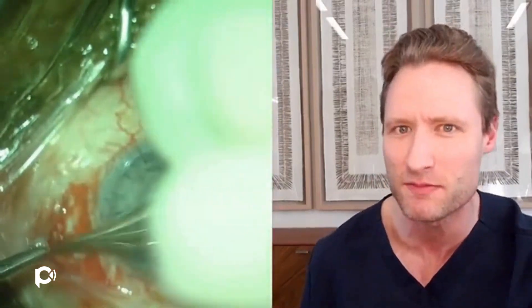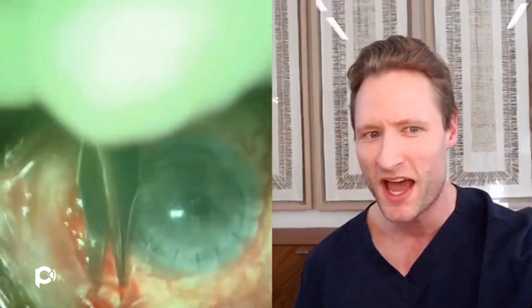Despite multiple prior surgical iridectomies, this aqueous misdirection and malignant glaucoma has been intractable. The eye being operated has a pressure of 40, a failing cornea, and the nerve is dying. So the question is: what can be done for this eye? How do you treat this horrific glaucoma? What do you do to reform the anterior chamber to protect the cornea?